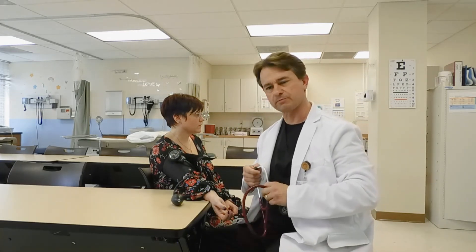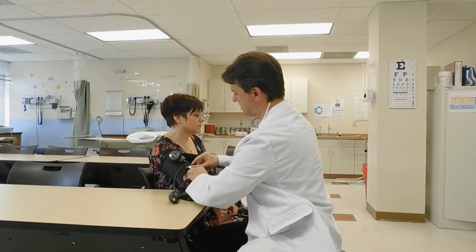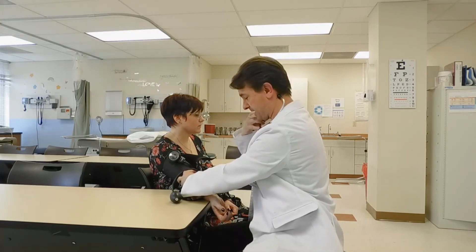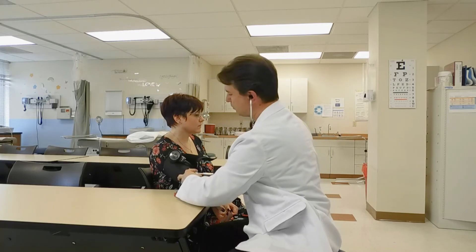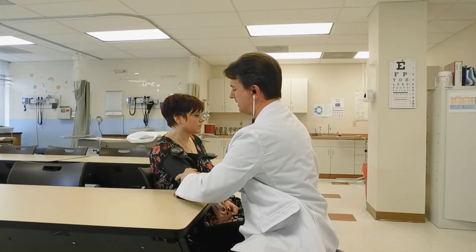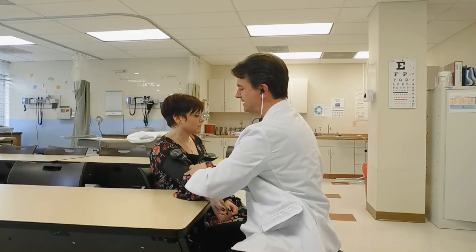Knowing now that I need to pump the cuff to at least 150 millimeters of mercury on the dial, I'm ready to begin taking the blood pressure. Correctly position the diaphragm of the stethoscope over the patient's brachial artery, very near the antecubital space, and pump up the blood pressure cuff to 150 millimeters of mercury. Using the dial, slowly let the pressure out about two to three millimeters of mercury per pulse. The first sound you hear is your systolic sound, and the last sound you hear is your diastolic sound.